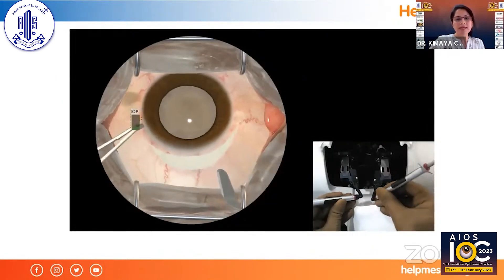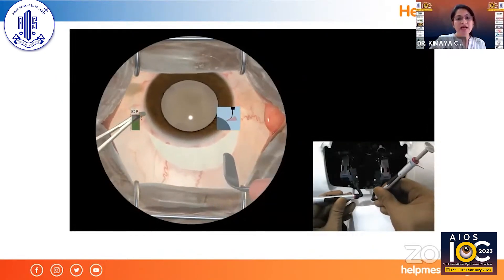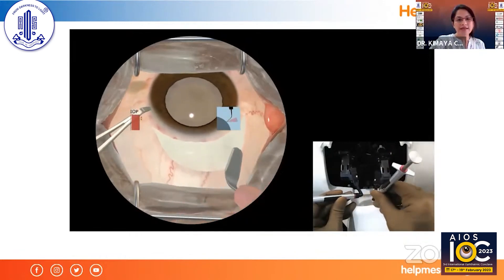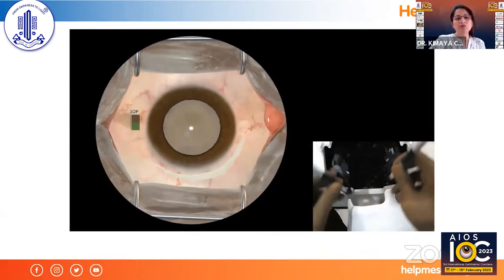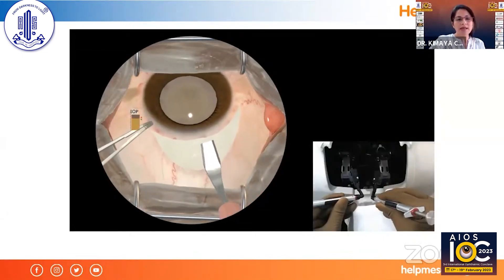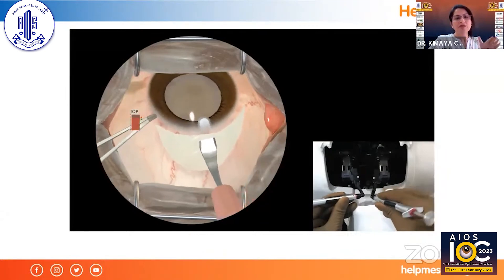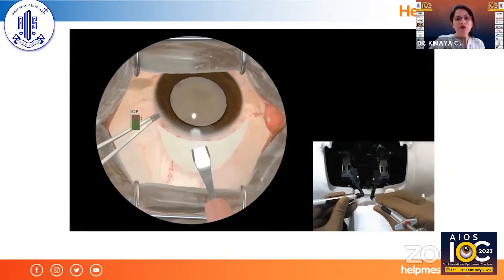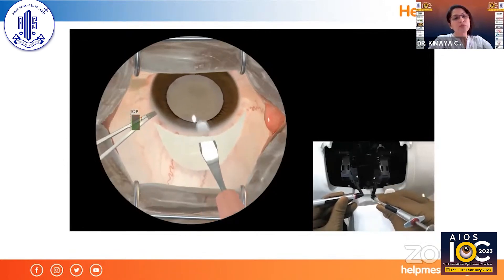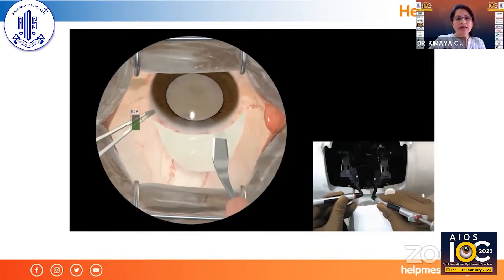Here on the right-hand side I'm using the haptics — you can see how I'm holding the instruments. I've chosen the crescent as my tool in the right hand to make a groove, and I'm using colibri in the left hand to stabilize the globe. You can feel the same resistance of cornea and sclera when making this tunnel, and you can see the intraocular pressure parameters — if pressure is too high, it turns red.